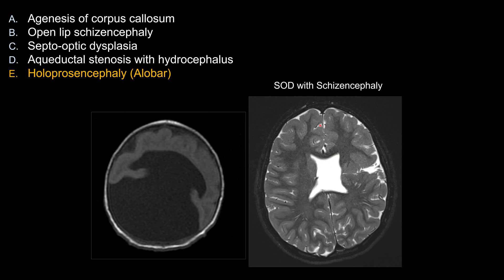In this case, this is an example of septal optic dysplasia with schizencephaly. You see absence of the septum pellucidum, and when I see that, I think about holoprosencephaly — and septal optic dysplasia on the board exam. Some people consider septal optic dysplasia as the mildest form of holoprosencephaly, but the division of the left and right side of the brain is complete, unlike holoprosencephaly.